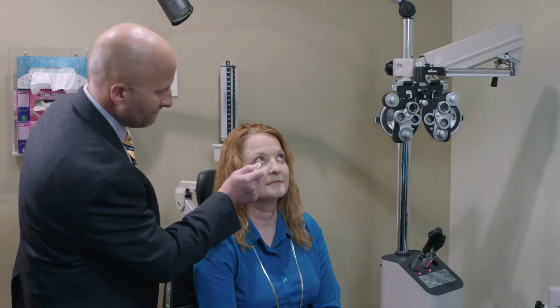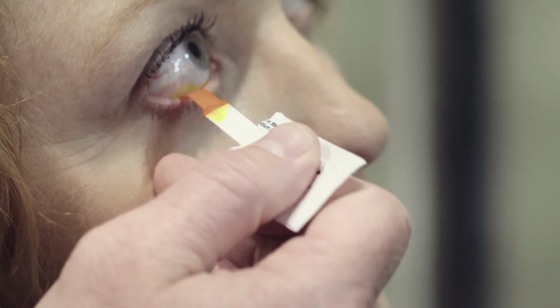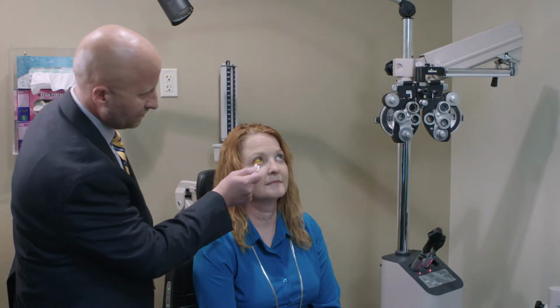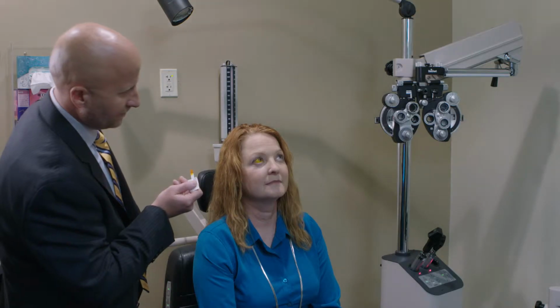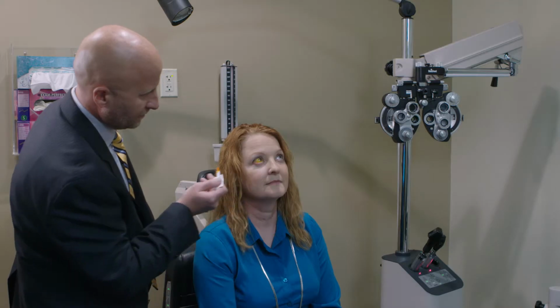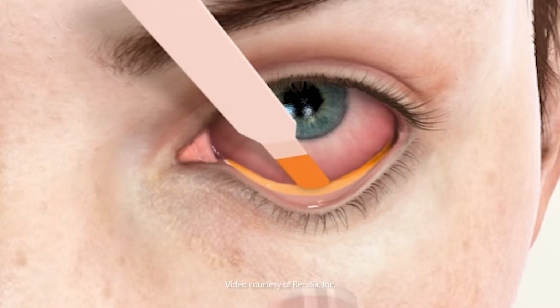We start with the fluorescein evaluation of the patient's ocular surface, which will highlight any of the damaged or irritated cells on that ocular surface. In other words, the dye helps detect corneal punctate keratitis all over the ocular surface. Additionally, it allows us to determine the patient's tear film breakup time. I like to see their tear film last 10 seconds, which is the average blink interval. Obviously, that blink interval varies, but an exposed cornea will lead to corneal staining.